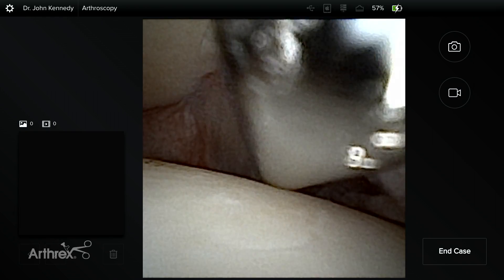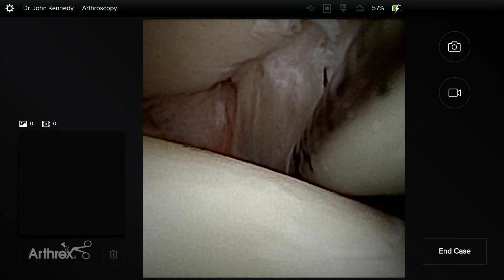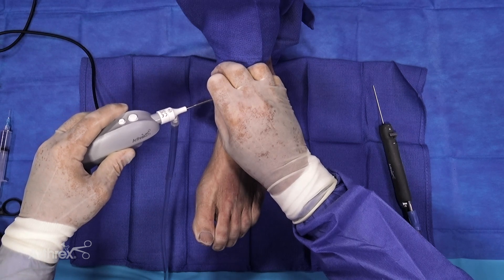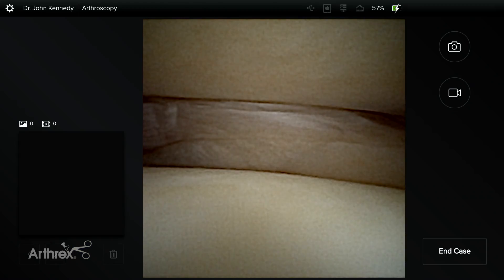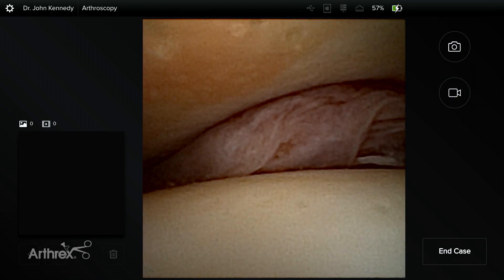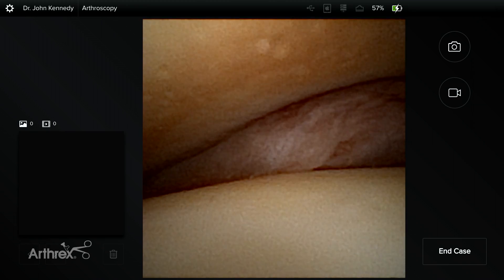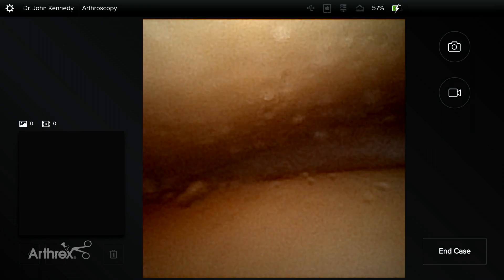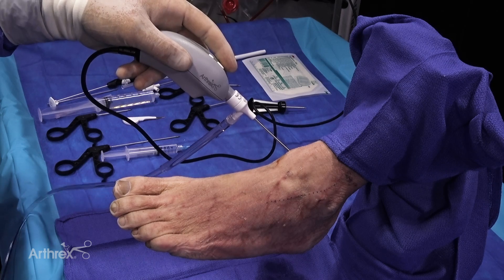You can see some striations in the cartilage, but overall the cartilage in this patient is quite good. Now we're looking at the rest of the joint — all the various points of interest. Normally when you're using a larger scope, you have to have the ankle under traction, but with a nanoscope at 1.9 millimeters in diameter, you do not need any traction. The joint has opened up very nicely. You can see right at the back here, this is relatively normal cartilage. Coming around now onto the medial side — again, relatively normal cartilage. There's a little bit of fluid in the way, so we can increase the pressure in our pump, which pushes some of that blood away.